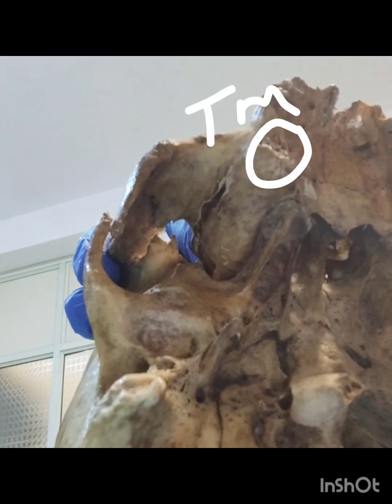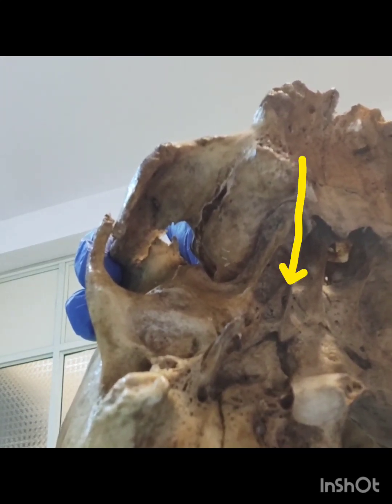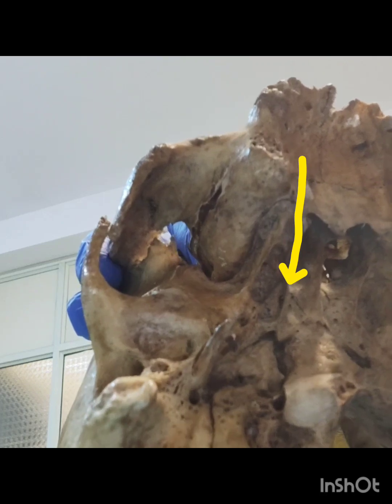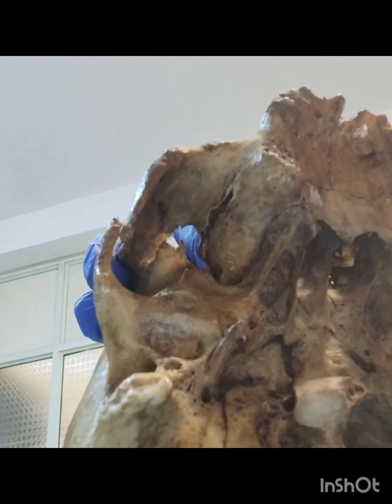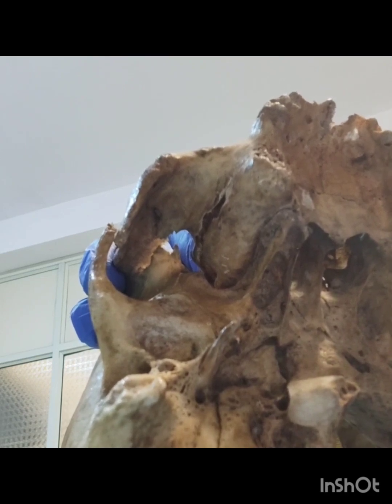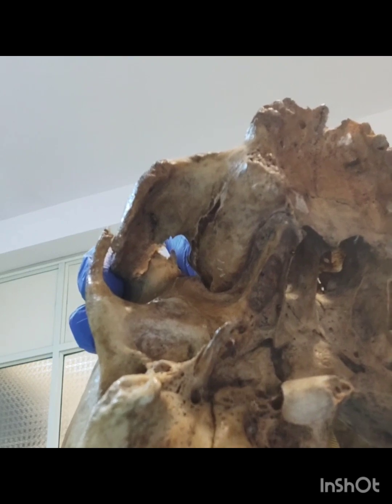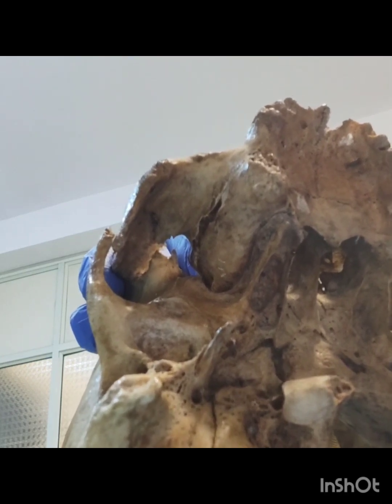So you have to do the osteotomy towards the medial pterygoid. So the area between the medial and the lateral pterygoid. So there your implant has to engage in the corticobasal implant system. Okay. So the approach is through the tuberosity area.